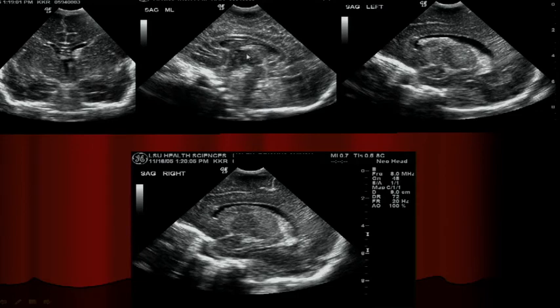And so in the middle, this is the massa intermedia, the interthalamic adhesion. You know what this is right here? That's the third ventricle. It looks big here because you're catching it like this. The third ventricle when you do these is real small. See how small it is? But if you caught it like you should, right in the midline, it's going to look real tall, and it extends back here. What's it called when the cavum septum pellucidum goes a little bit further back? Cavum septum vergae, and then when there's one way back here underneath, the cavum velum interpositum.